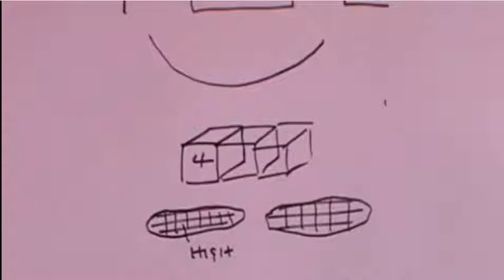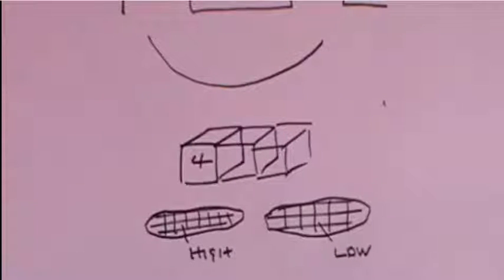As we know, a lung is almost all made of air, and air lets the beam pass almost completely. If we know the coefficient of this lung, we will know that the coefficient is very, very low. I mean, the beam almost passes completely.